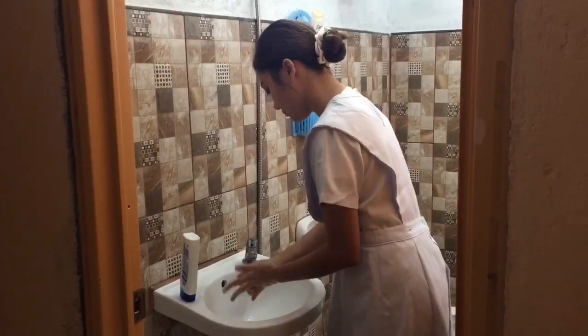Okay, so the first procedure is to review the physician's order for oxygen to ensure that it includes method of delivery, flow rate, and duration rate. Second is to perform hand hygiene.